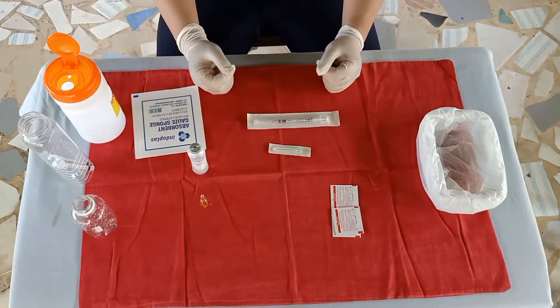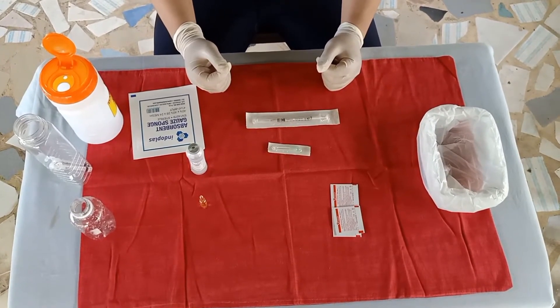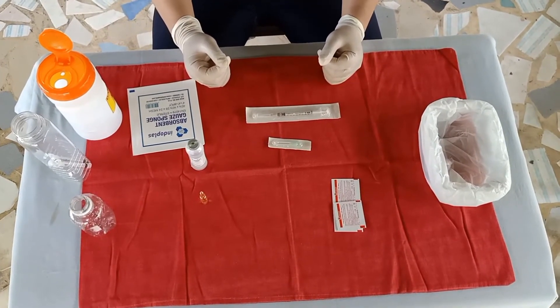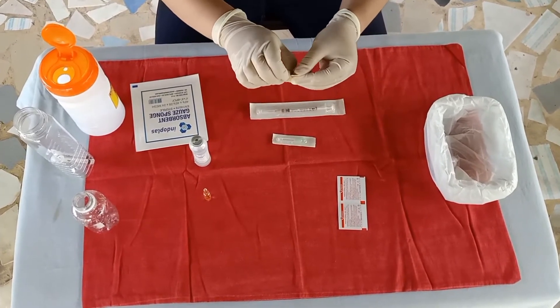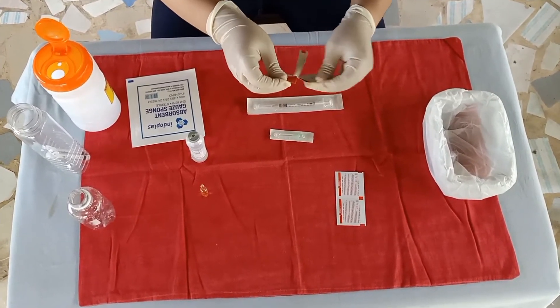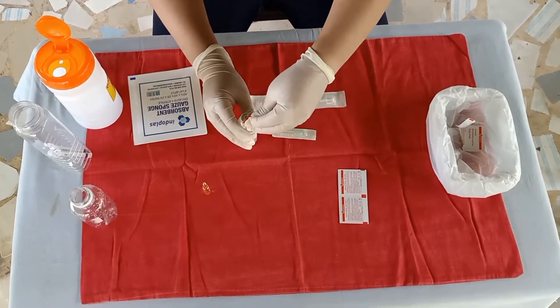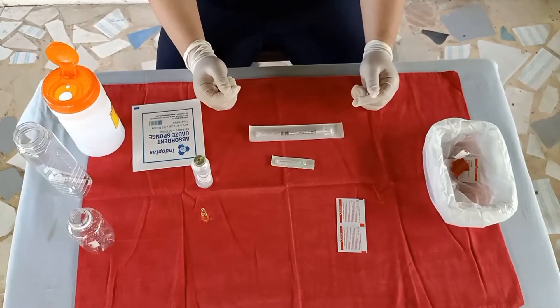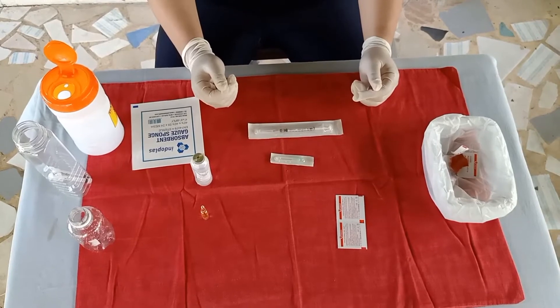Remove the protective cap or clean the rubber cap of a previously opened vial with an antiseptic wipe by rubbing in a circular motion. Attach a withdrawing needle to the syringe and ensure that it is firmly attached to the syringe.